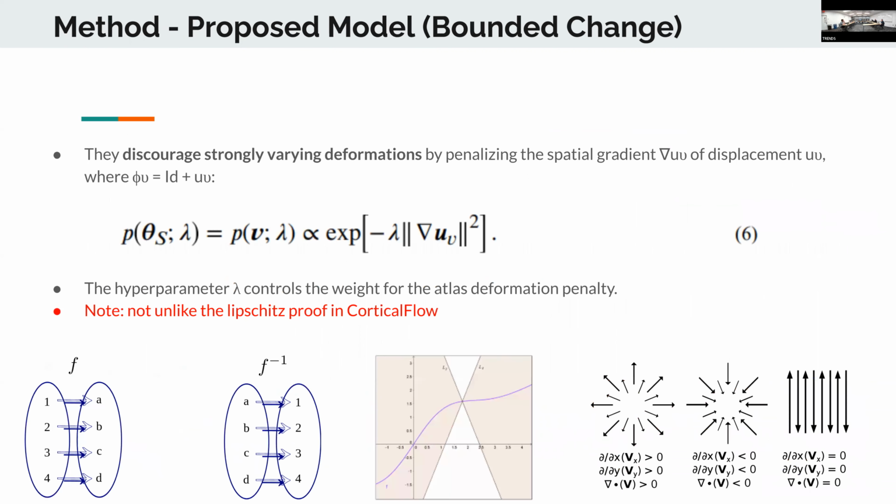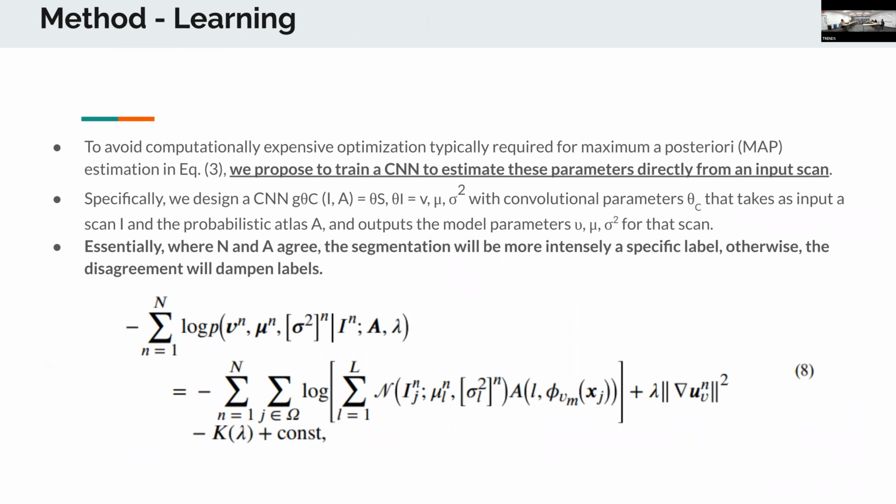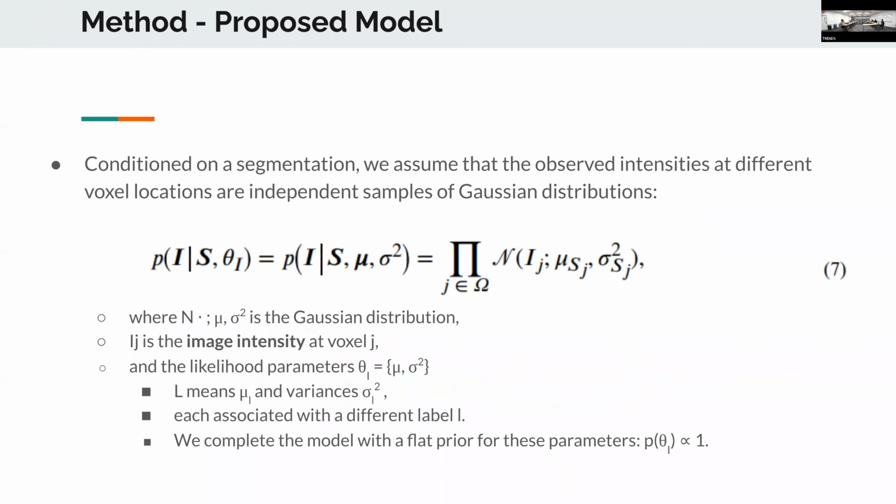But this mu sub L, is it the size of the voxels, in voxel space? No, it's per image, per label, one scalar. They build a distribution, you can look at the code, based on this average and this standard deviation for each label, and then they sample from that probability distribution for each voxel.